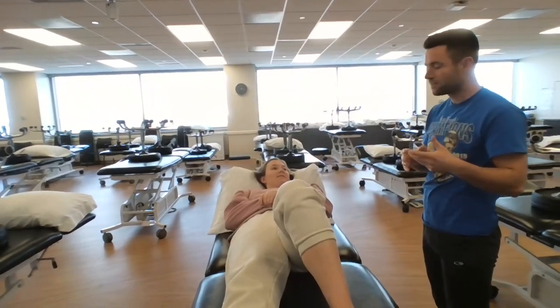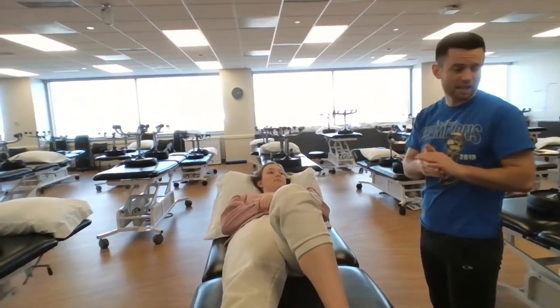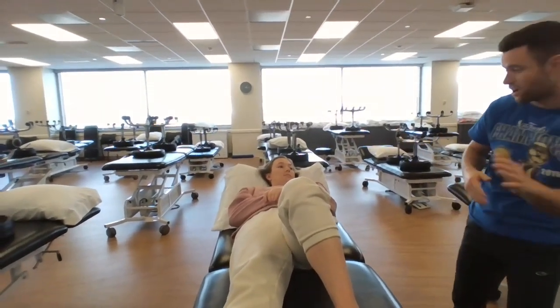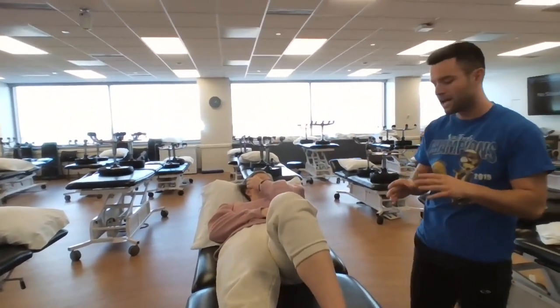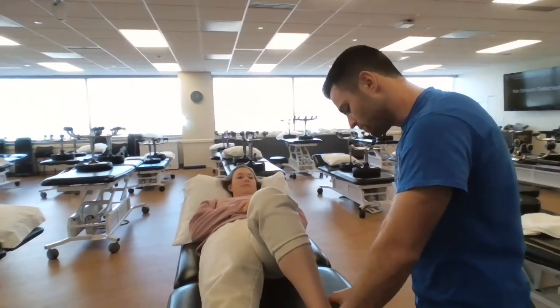Okay. So I'm going to have to put my hands and this ultrasound machine on your ankle. Are you comfortable with that? Okay, great. I'm just going to go ahead and look at that ankle real quick, just make sure there's no wounds going on.